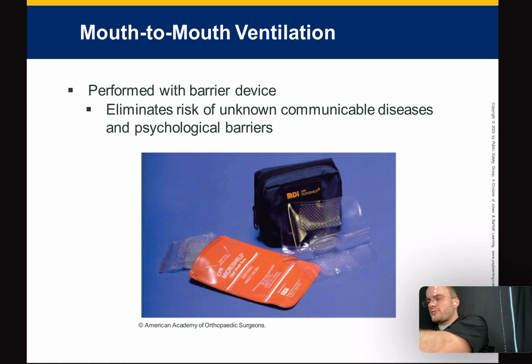Okay, so there is mouth to mouth ventilation, but they're never going to ask you to do mouth to mouth on the National Registry. Calm down, but there are places that will use a mouth to mask. What you can do is take one of these masks, and this one doesn't have it, but there will be a one-way valve attached here, where you'll put this on the patient's face and blow into it. All this equipment's new, by the way, so that's something to keep in mind when I get it close to my face. You want to use a barrier device. So that's a mouth to mask.